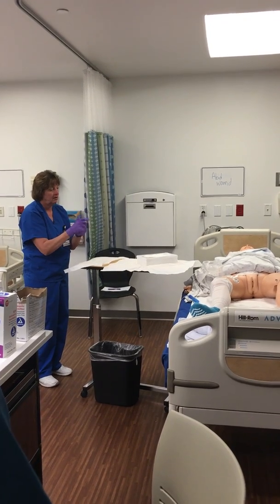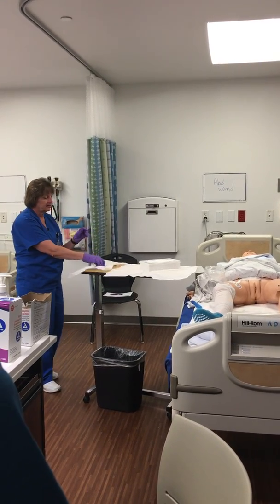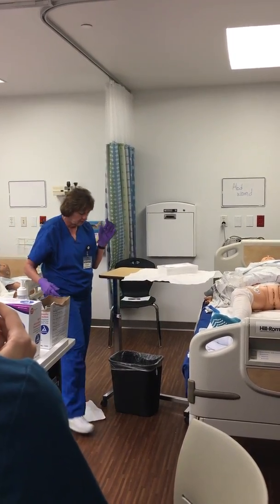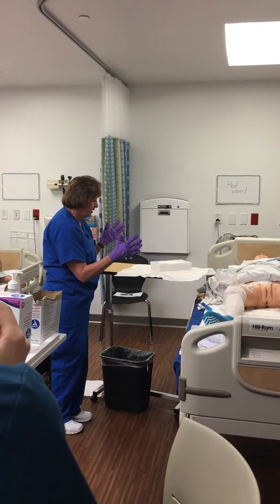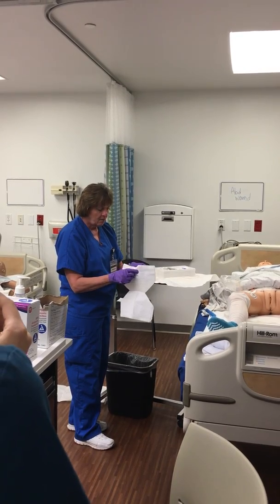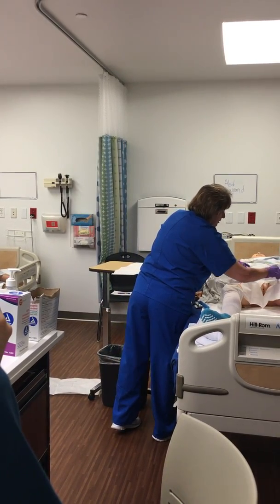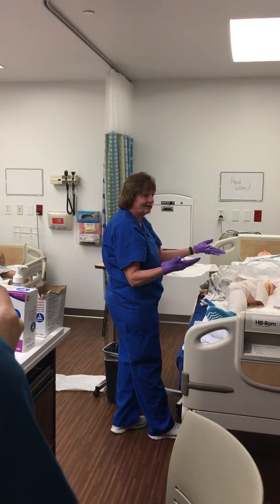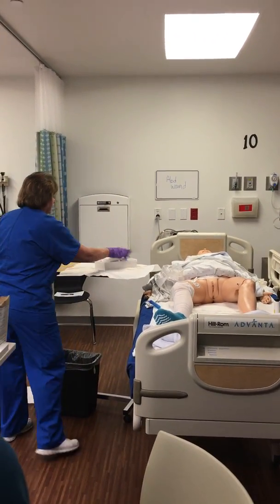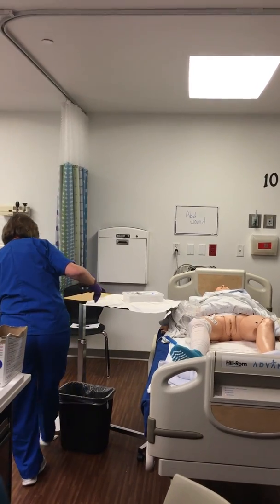Could you utilize that paper to the inside of where the gloves are to place supplies on if you need to? Yeah, but you won't need to. So what I'm going to do is just get rid of this. If my trash is handy I'll throw it, otherwise I'll just let it go and pick it up later — I just don't want to slip on it. So now I'm sterile and I can start working in my kit. This is called a fenestrated drape. You can use this if you want, but all it ever did for me was get in the way and possibly fall down. It's not like you need a bullseye anyways — you know where you're going. So what I recommend is take this out of the kit and throw it in your trash.